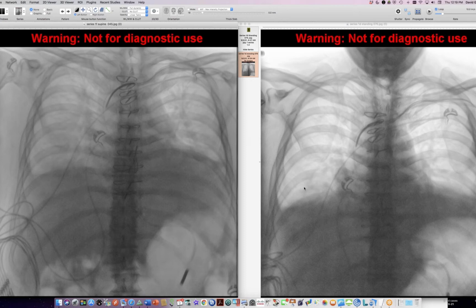I'll have the patient breathe deeply, and I'll have the patient sniff. And then after doing that, I return the patient to AP view standing, and I will watch the person take 2 deep breaths standing, and then I'll tilt the table back 45 degrees. I'll watch 2 deep breaths, and I'll tilt the patient all the way supine and do 2 deep breaths.